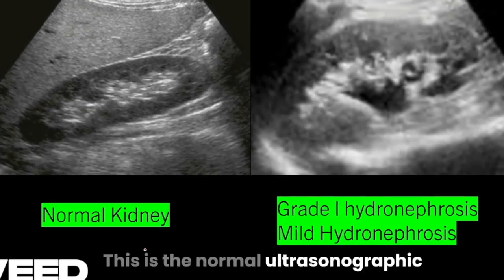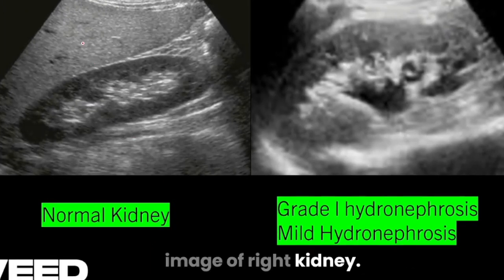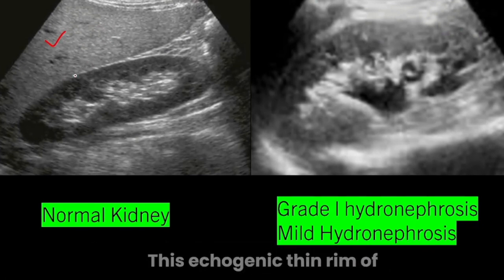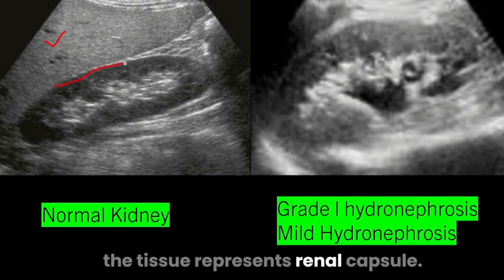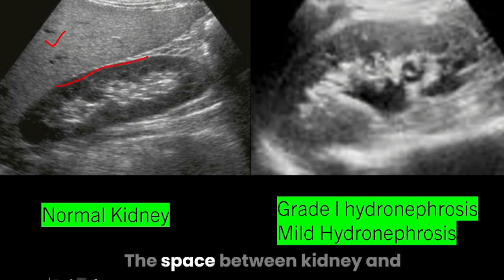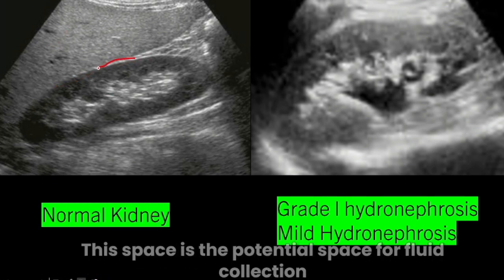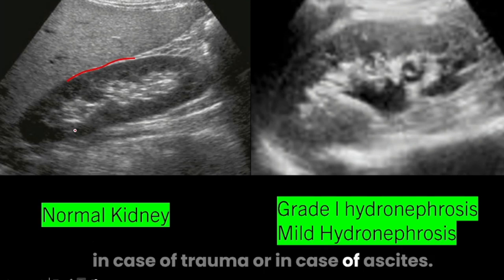This is the normal ultrasonographic image of the right kidney. Here you can see this slightly hyperechoic, homogeneous-appearing structure is the liver. This echogenic thin rim of tissue represents the renal capsule. The space between the kidney and liver is called the hepatorenal space. So this space is the potential space for fluid collection in case of trauma or in case of ascites.